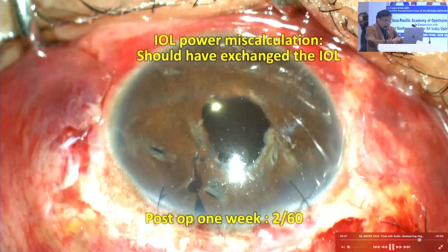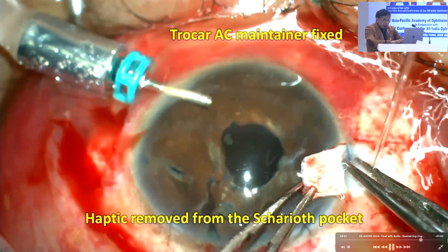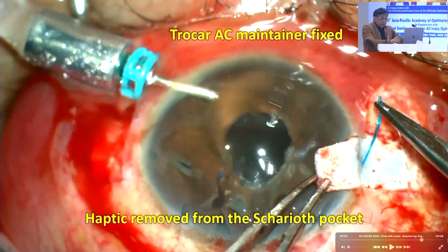So anyway, now question comes, what to do, Rohit? What about you, Gaurav? The power was too much for me to do a laser on him, okay? The cornea is not thick enough for me to do the laser. So, Gaurav? Yeah, so you'll have to go for an IOL exchange, sir. I think there's no other choice. So that's the only way I could do it, but Kumar, there's a small problem here. I already have created a small pupil. Now, what would I do, Kumar?